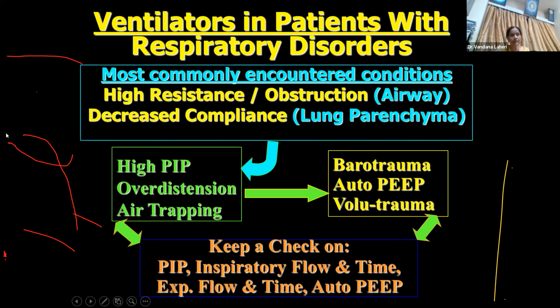So ultimately, where do you use graphics? To keep a check on PIP, on whether inspiratory flow is adequate, inspiratory time (I'll show you one graph on how to make out whether inspiratory times are adequate or not), expiratory flow, expiratory time, and autopeep. So this is what you can detect on graphics. Okay.